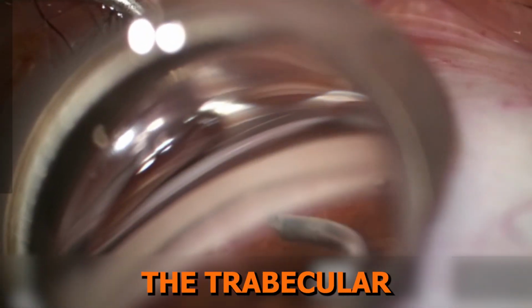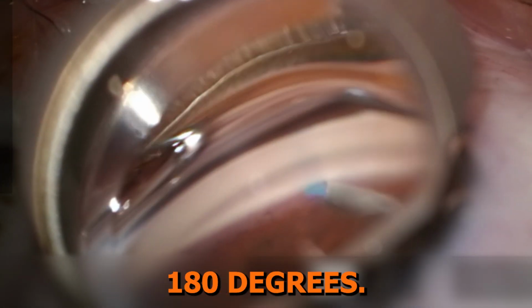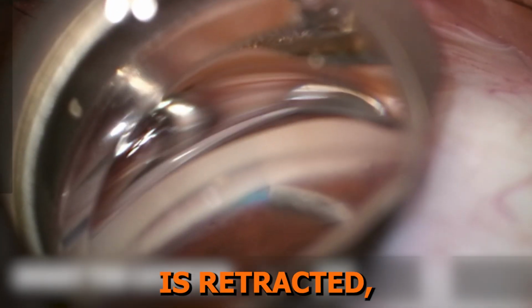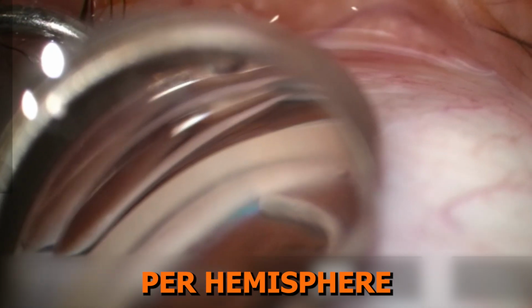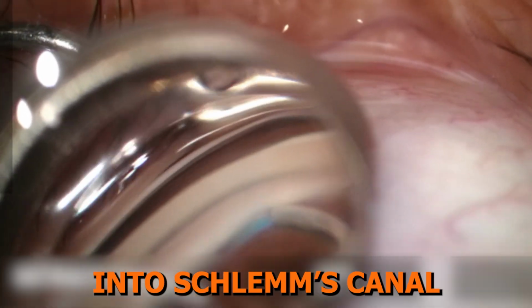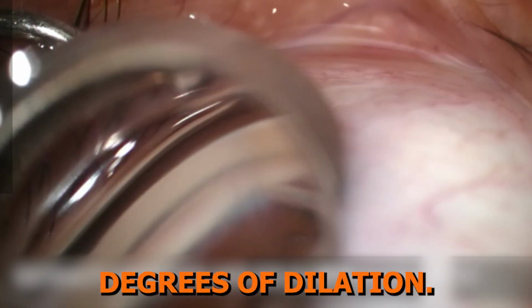After piercing the trabecular meshwork with the tip, the catheter is advanced with a finger wheel for up to 180 degrees. Then the catheter is retracted, allowing for delivery of small amounts, about 5.5 microliters per hemisphere, of viscoelastic fluid into Schlemm's canal. This can be performed on both sides for up to 360 degrees of dilation.